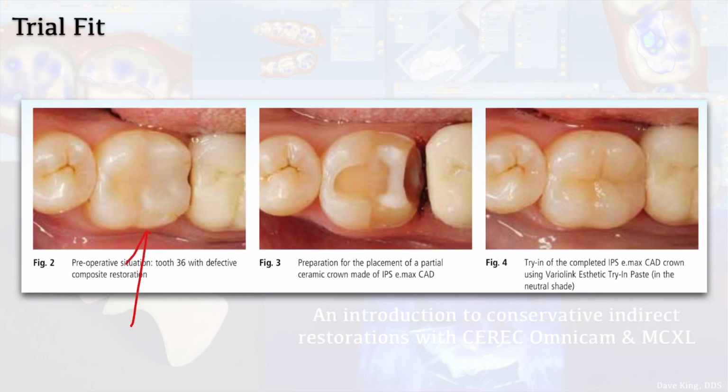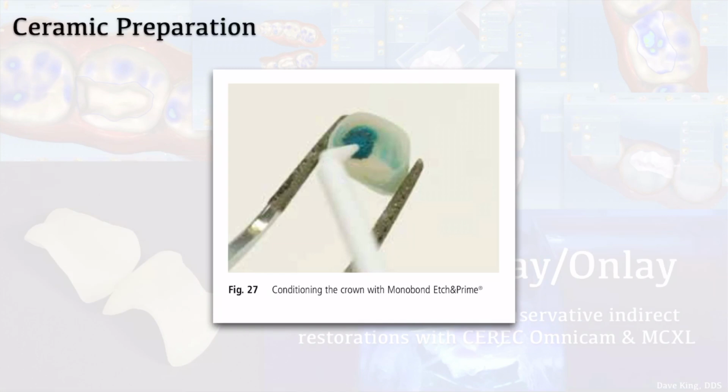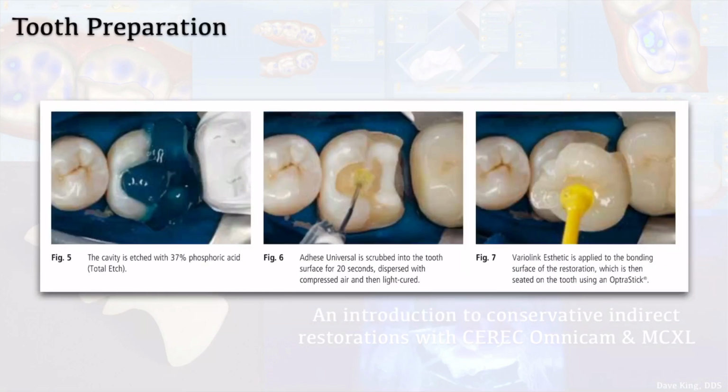So here's the pre-op. Here's the preparation. Looks like they either left some composite or put a buildup in there. And then there's the post-delivery. I'm sorry, that's the try-in. This is the etching with the etch and prime. So they're scrubbing it. There's this 20-second scrub and then a 40-second reaction time. There's a total etch and a rinse.